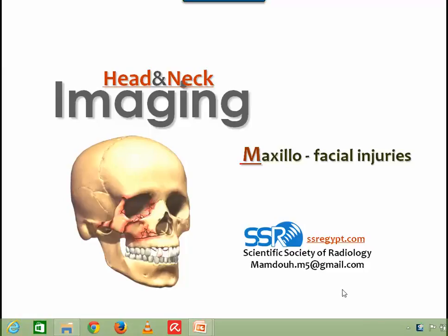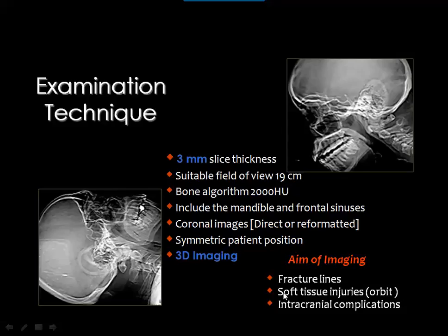Dear colleagues, now we are going to handle one of the important topics in head and neck imaging, which is maxillofacial trauma. You know that the face is one of the commonly injured parts in the human body, and is frequently assessed by imaging, especially in our days by the CT scan.